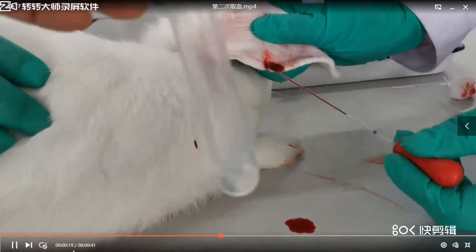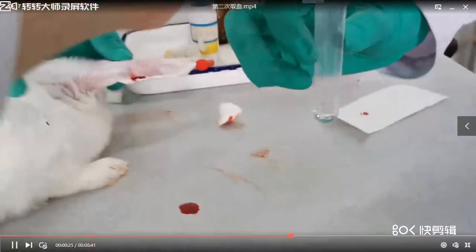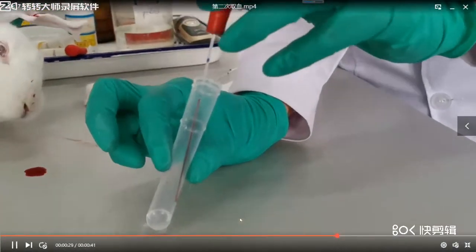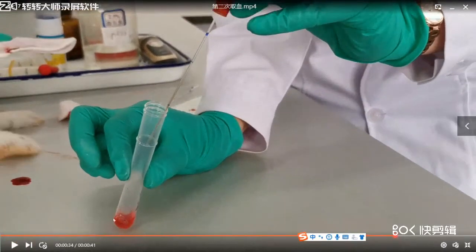Okay. And put this 20 microliters of blood into the second tube. And the other student, don't forget to use cotton. Okay. In the tube there is 1 milliliter distilled water, and then we add 20 microliters of blood into the second tube.